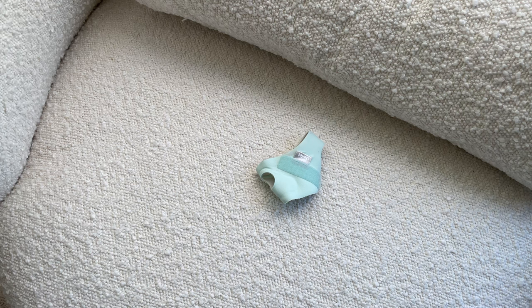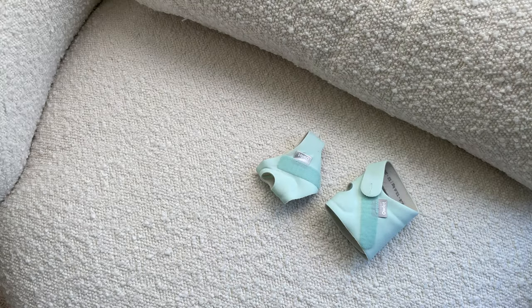First, the Owlet Sock 3 comes with two different sizes — a left and right sock for newborns up to 12 pounds, and then a left and right sock for up to 30 pounds. We appreciate this because it gives us the opportunity to wash the sock he's not using at the time, as well as alternate which foot we put the sock on so it's not always strapped to the same foot.